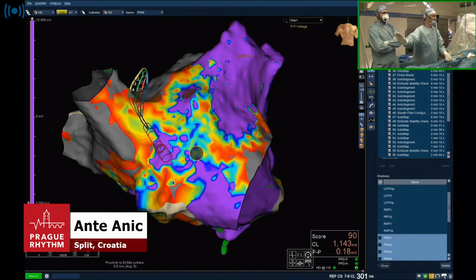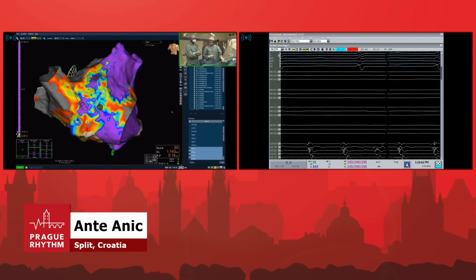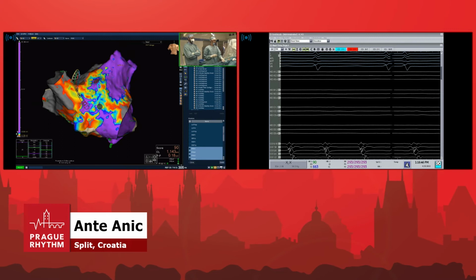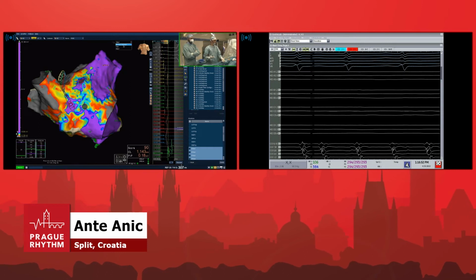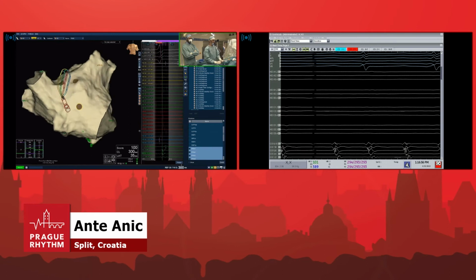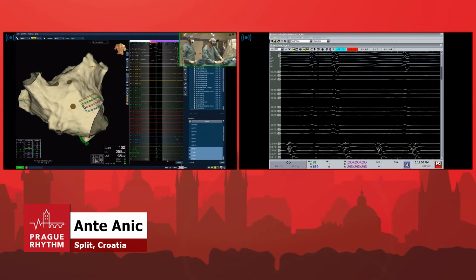Stop. So now we induced something, and you see that the activation is proximal to distal on the CS. So this is a very, very expected outcome. It seems to be a stable arrhythmia. So I'm glad that now we are having a multipolar mapping catheter. So we have to proceed, and probably we're going to find a critical isthmus up there on the anterior part of the atrial wall. And then we'll probably have to ablate more.